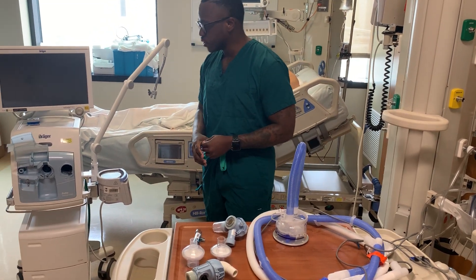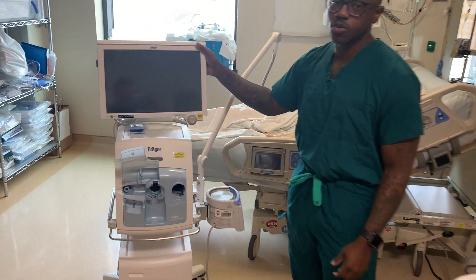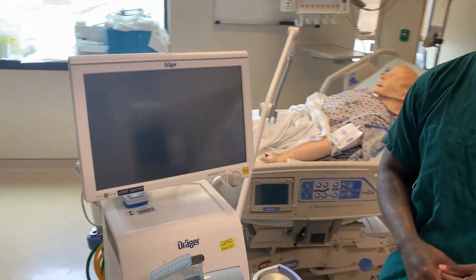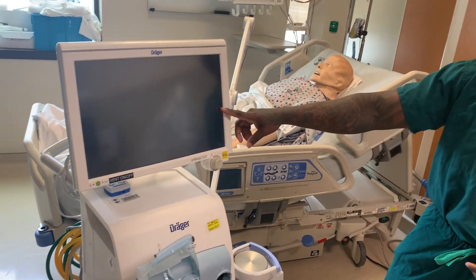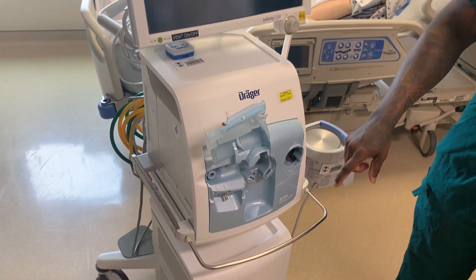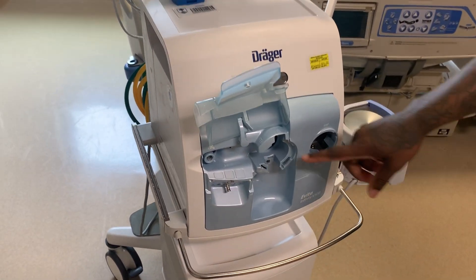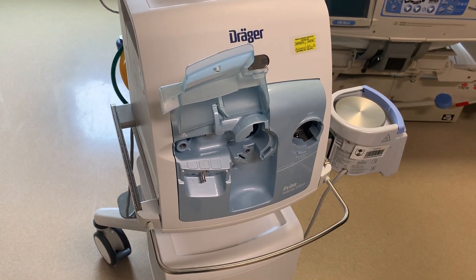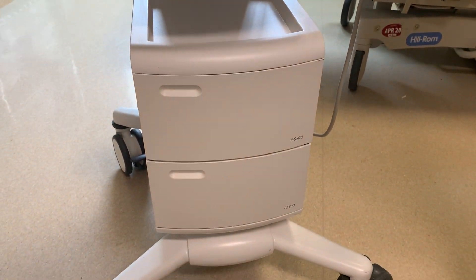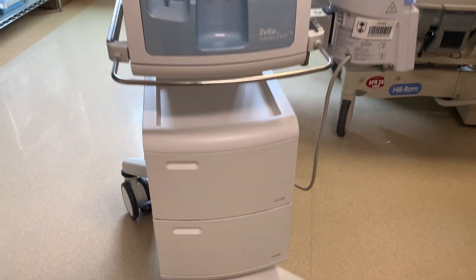For the Draeger, this top piece is your provider interface. This is where you're going to be inputting all your settings and monitoring what your patient is doing. Below here you have an inspiration port and an expiration port and a place for a flow sensor. These bottom boxes down here are your air compressor and backup battery.